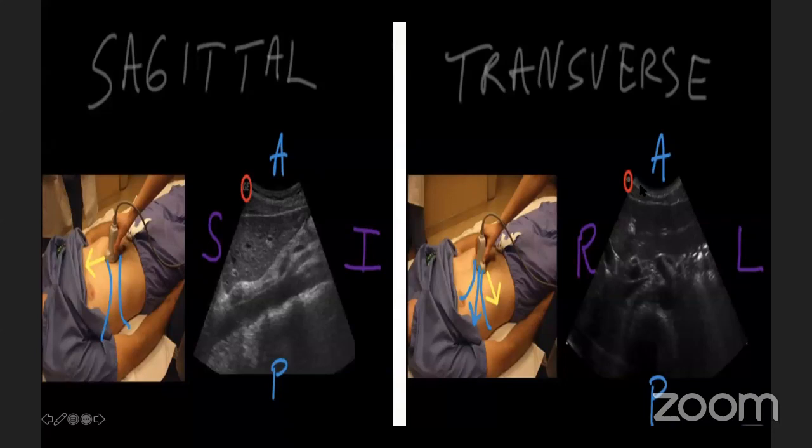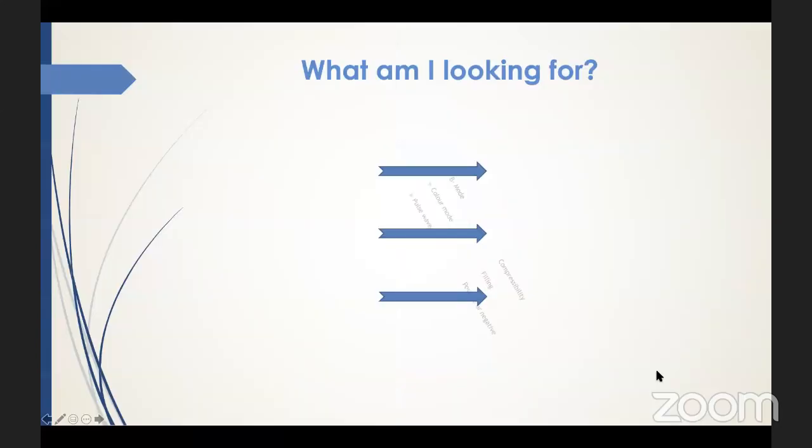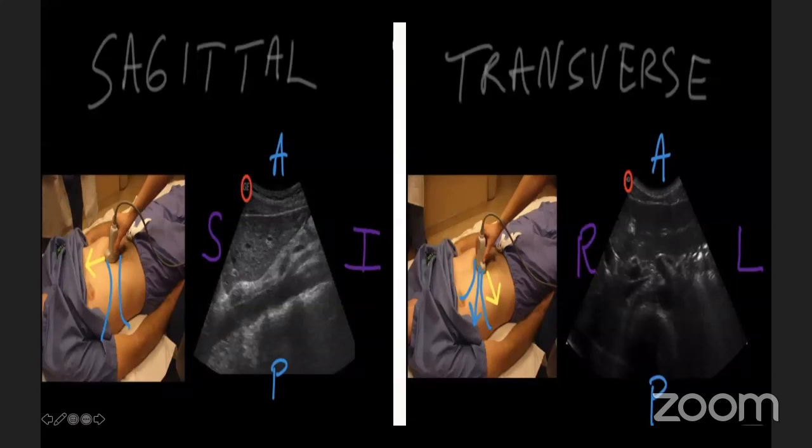The near field here would be anterior, which is the patient's tummy or abdominal surface, and this is the patient's back, or posterior aspect, sorry. In the sagittal longitudinal view here, if we take the marker towards the patient's head, then it corresponds to the marker here in the top left of our screen, and therefore this is the superior aspect, inferior aspect, near field, which is anterior, and posterior, which is the patient's back. I hope this is quite clear, because it's quite important to know the orientation of your probe and the orientation of your ultrasound screen.